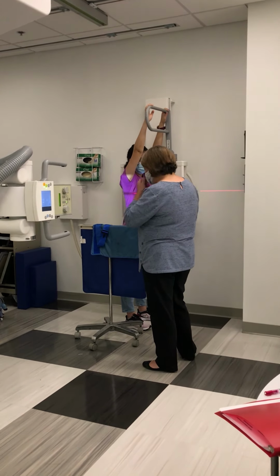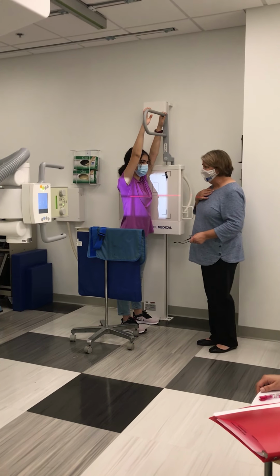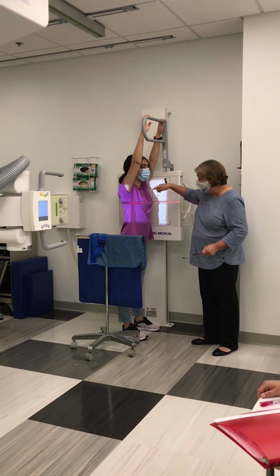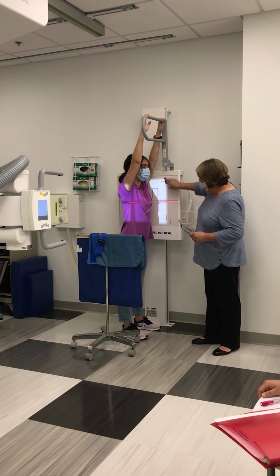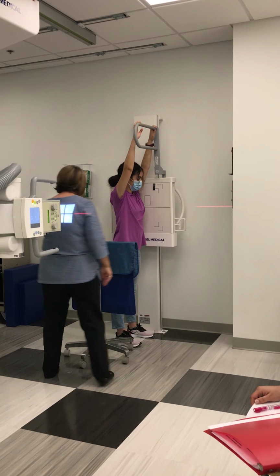Again, I'm centering at T7. Now if I'm looking anteriorly, that's about 3 to 4 inches below the jugular notch. Now I'm gonna just touch lightly, just a place on your neck here, so you feel for that indentation. And you eyeball, measure down about 3 to 4 inches. And so I think I'm centered correctly at T7.